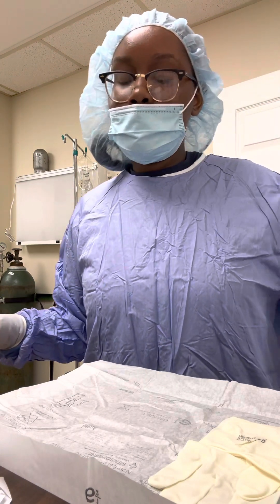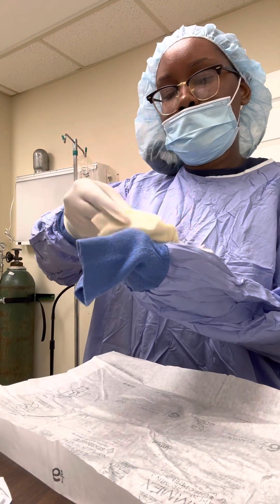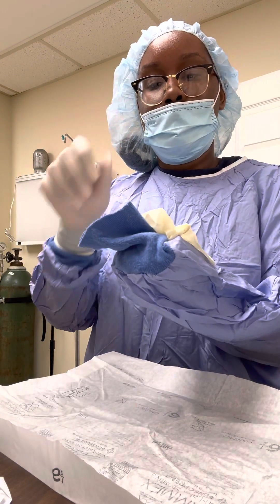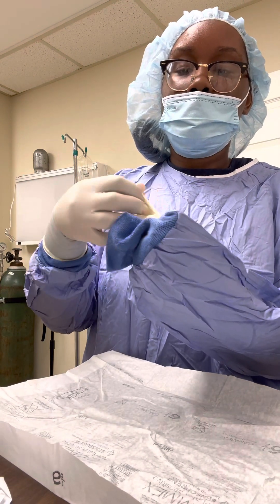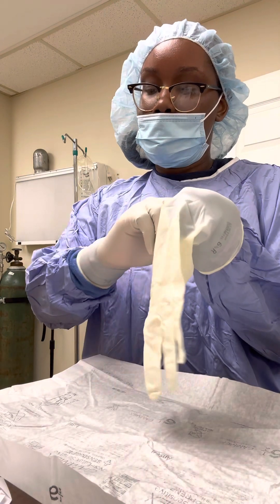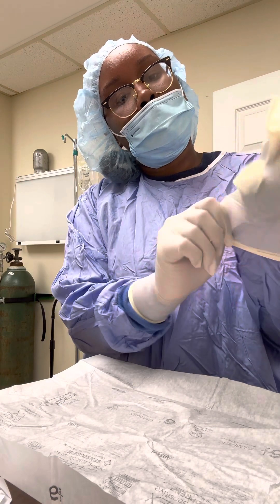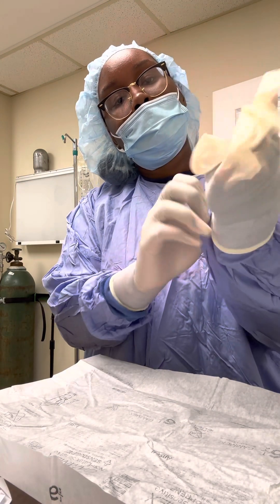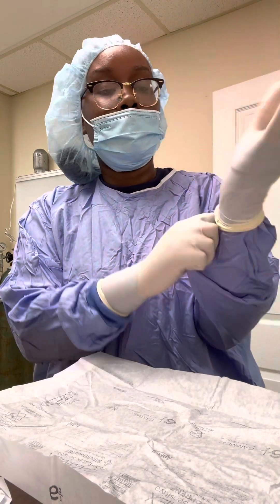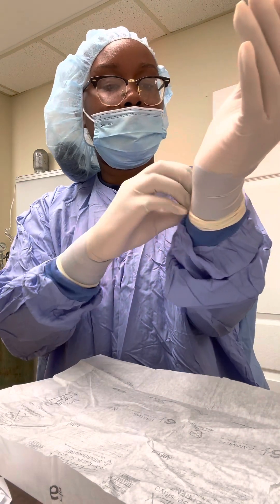Now I'm going to repeat the same steps. I'm going to place this onto here and grasp it like this, then pull it over my hand. I'm going to slide my fingers on in there. My cuff is all the way up by my hand, but it doesn't need to be that far because it's a little uncomfortable — it just needs to be covered. So now I'm going to cover it completely.